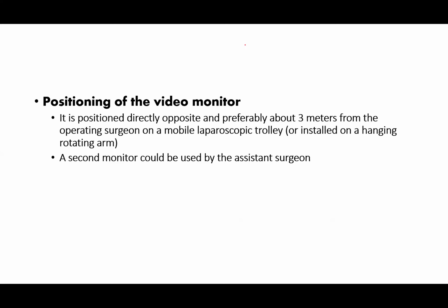That's what differentiates a laparoscopic video monitor from an ordinary monitor. The laparoscopic monitor will have several types of connections, not only USB, not only HDMI, DVI, BNC, SDI, so many types of connections that can be connected to various devices.